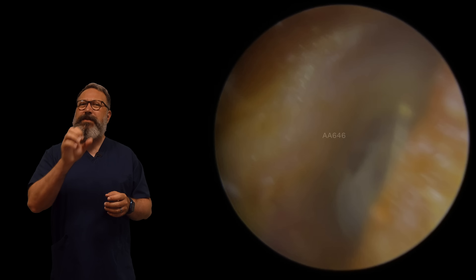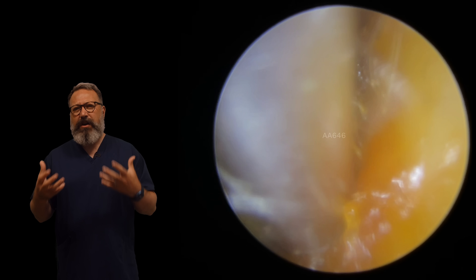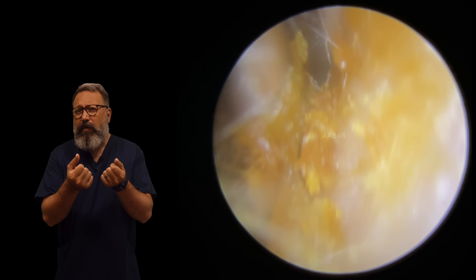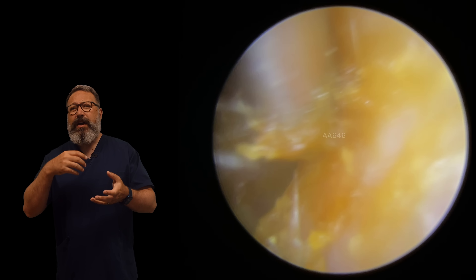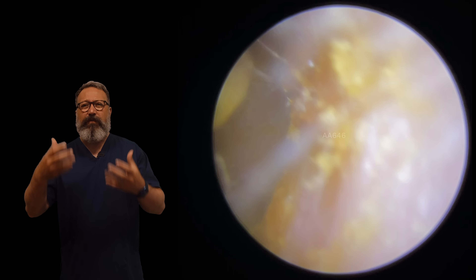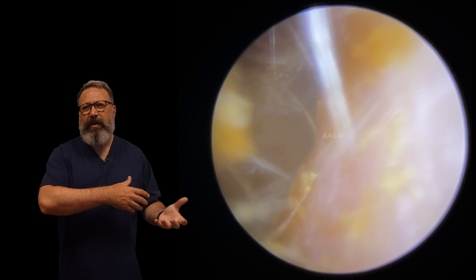Eardrum there. Now the eardrum doesn't look particularly healthy, but it's nothing to be concerned about. That looks like a lot of scar tissue to me. You can see that really milky appearance to the eardrum when we look back in there. That's usually an indication that the patient has either had a lot of infections, a lot of perforations, probably some operations on their ears as well.